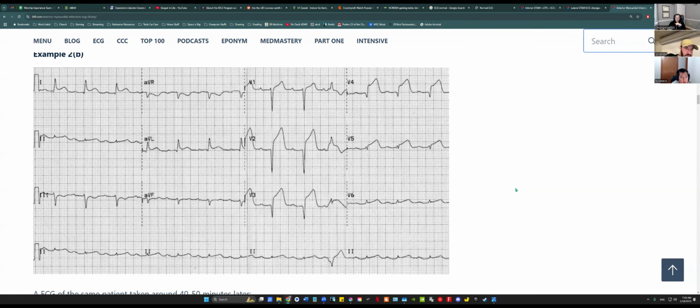Two. Well, let's look at it. Where is it? Is this the P wave? All right, so this is the baseline now, right? I usually like to use the PR as the baseline. It's kind of electrically boring, so it's just going to sit there in a flat line. Here's the QRS. What the hell is this? That's the T wave. STEMI. Yeah, this is like six little boxes up. This is huge.